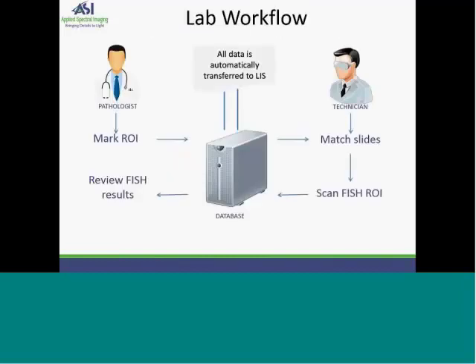Having discussed the process and technical workflow, I wanted to discuss briefly how we envision the workflow within the lab. After the pathologist marks the region of interest on the H&E slide and saves it in the database, the FISH technician will be able to open the FISH slide in the software, match the slides, and then go immediately into a 60x scan at the region of interest. The scanned image and the results are saved in the database, and the pathologist can now come in and review the results. And of course, I should mention that all actions performed are saved in our database, as well as being automatically transferred to the lab's LIS.